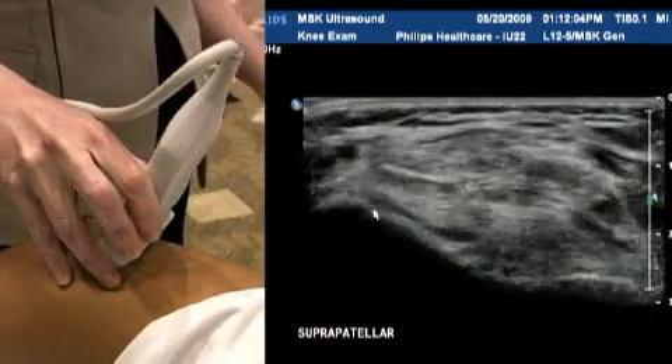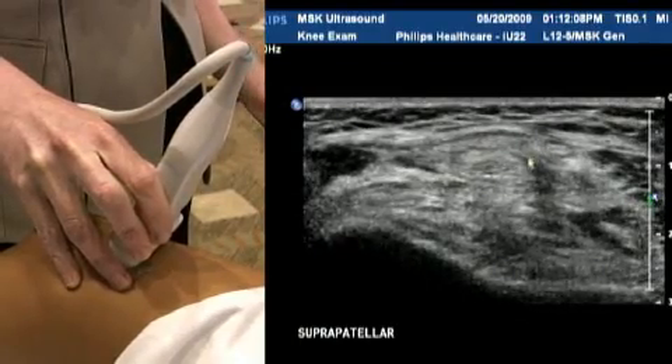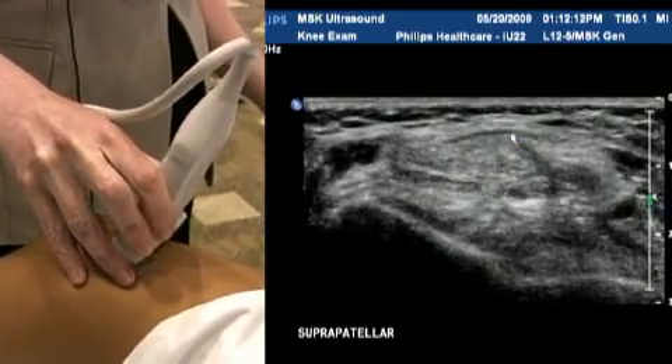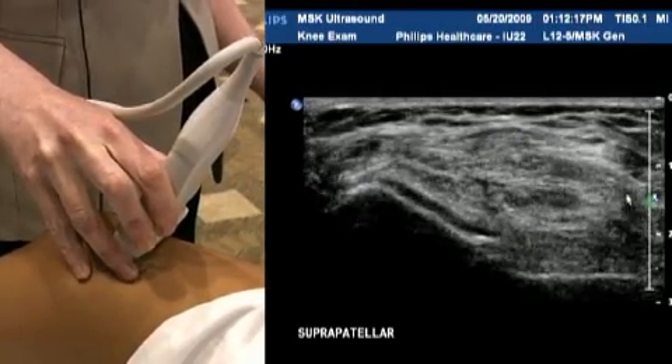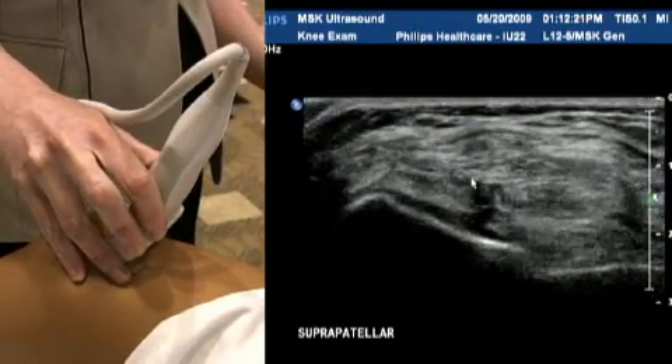We go down to a transverse section now, watching the quadriceps tendon. As I said, it's quite a wide tendon side to side, which is why the linear 12 is a good choice — it's got such a wide face. You can see the tendon in its entirety; it looks nice and homogeneous and is quite an echogenic tendon.